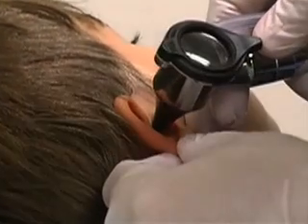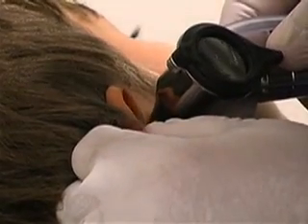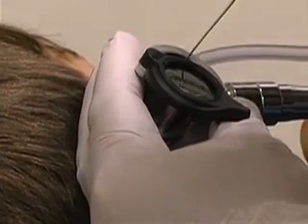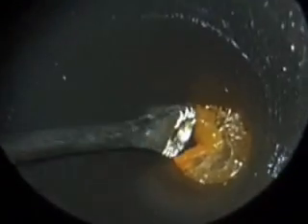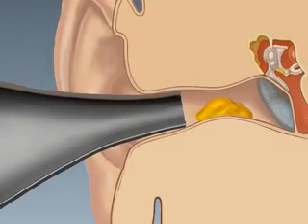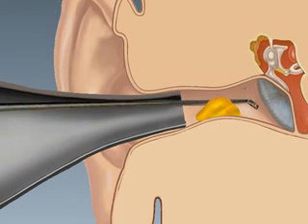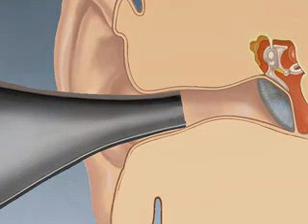With the child fully immobilized and the head secured by an assistant, insert the otoscope into the external auditory canal using your dominant hand. Once in the proper position, use your non-dominant hand to hold the otoscope in place. Partially displace the lens of the otoscope and insert the blunt ear curette into the speculum. Under direct visualization, advance the loop of the curette behind the piece of cerumen, being careful not to traumatize the walls of the external auditory canal or the tympanic membrane.